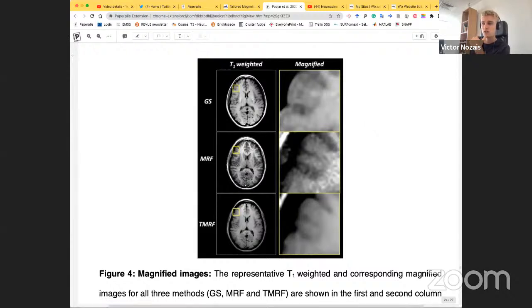I'm not against denoising algorithms, like deep learning denoising algorithms or anything, but I'm still wondering if we are at a point where we can just apply them all the time. I would really like to see the same thing that they did, unless the tailored part is necessary, you need the deep learning for the tailored part.